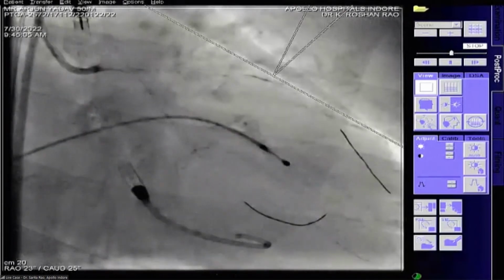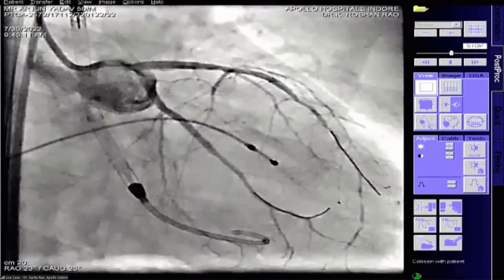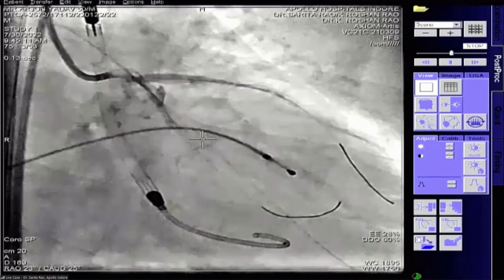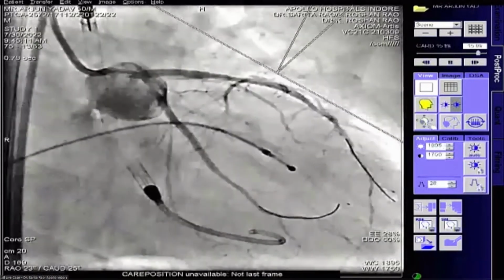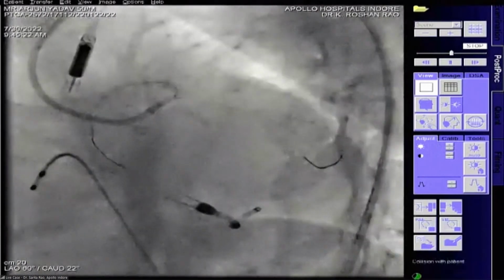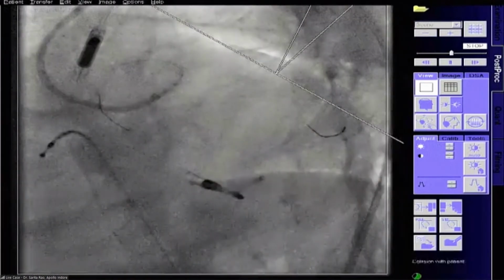In fact, since it's an infarct-related artery, you might as well go ahead and check the viability in the right, actually. You may not need anything, absolutely. Anyway, the data also shows that everything need not be done in one go. You can stage it also. But I will leave it to you, madam. I think once you show us the final picture, we would congratulate you. Okay.